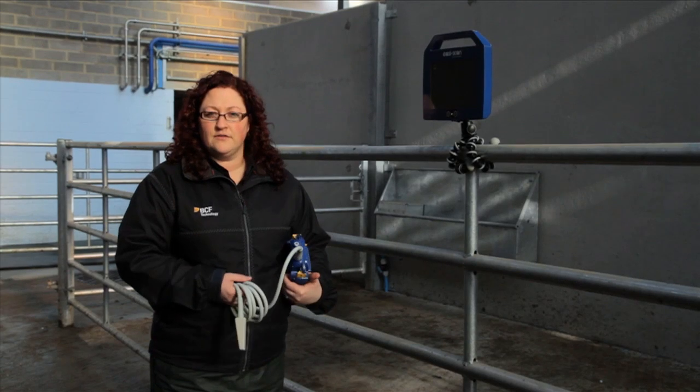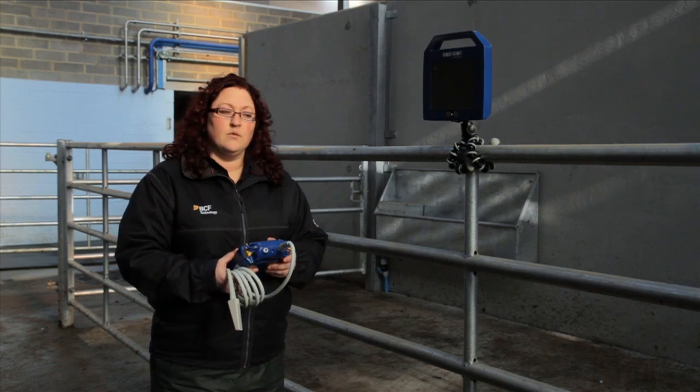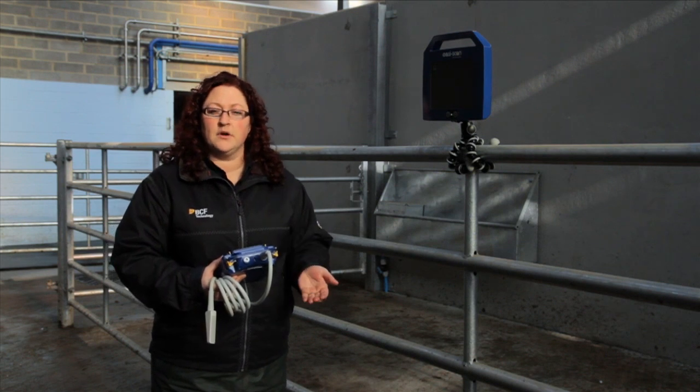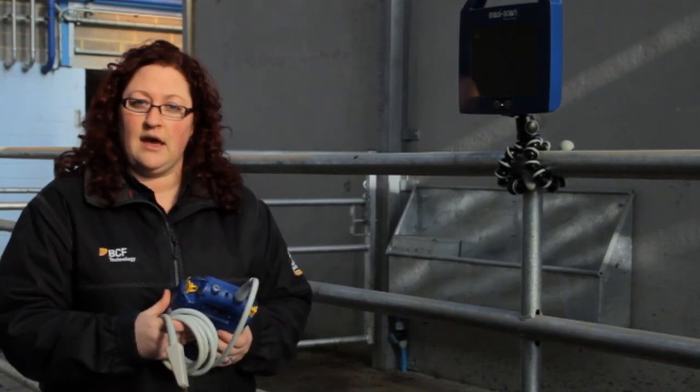Today we're in England at Langford Village and we're here at Wyndhurst Farm, which is part of the University of Bristol Veterinary School. Today we will be giving a step-by-step guide on the use of ultrasonography for evaluation of the bovine reproductive tract. In these sets of instructional how-to videos, what we'll be looking at is machine setup before we get started. We'll also look at how to restrain the cows, ensuring that we're in a safe working environment. We'll then look at how to actually hold the probe, and finally we'll look at actually scanning the cows.